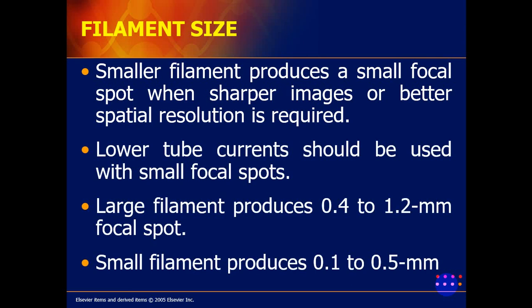So ganito yon. If ang kailangan mo pag nag-X-ray ka is kailangan mo ng detail, you have to use a smaller filament if kailangan mo ng detailed and smaller area. Pag kailangan mo naman ng bigger area and not so detailed, so gagamitin mo is large filament. So paano namin malalaman, ma'am? Saan ba namin i-adjust? So you will adjust that in the control console. May nakalagay doon large filament or small filament.